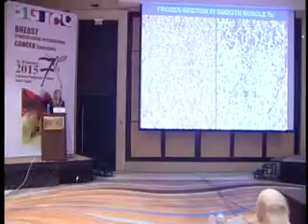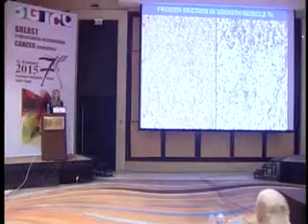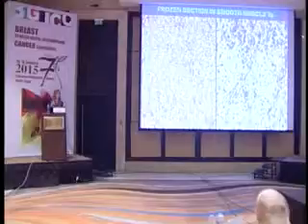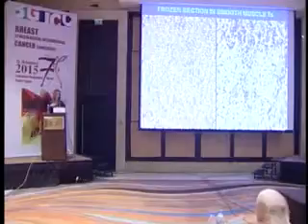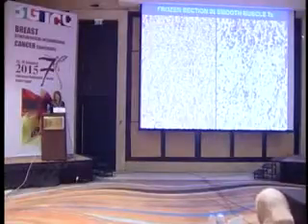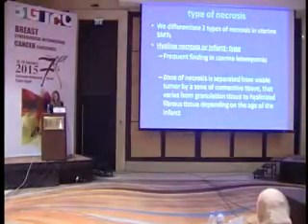I go to my ABC whenever I have any tumor in the frozen section. Do I have the mitosis? For sure. The significant cytologic atypia. The growth, it's a very soft tumor. It's not rubbery, the same as the leiomyoma. The margin is infiltrative, it's not smooth anymore. I cannot read the margin very well. So put it all together, the growth and the histology together. Oh, so this is the three things.